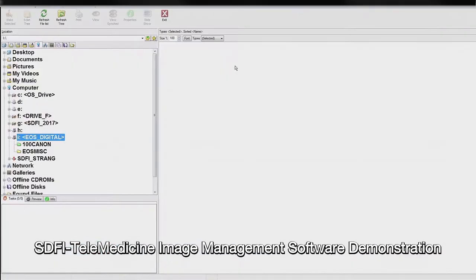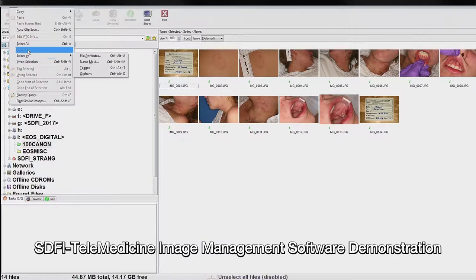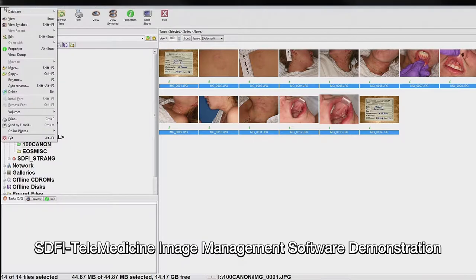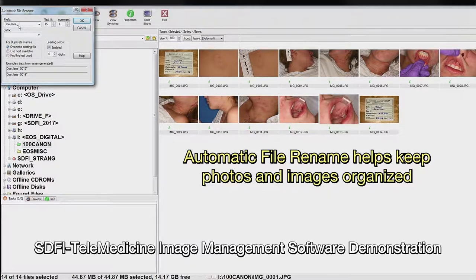Begin by verifying that the secure location for securing and storing your forensic exam photos and documentation is available on the exam computer. This location will vary depending on your facility or program protocols and procedures. If the location where you store your forensic exam data is not accessible, please take the appropriate steps to connect the computer with your secure storage location. This location may be from an external source, such as an encrypted USB drive that needs to be plugged in, or it may reside on network-attached storage that requires secure credentials to connect to.